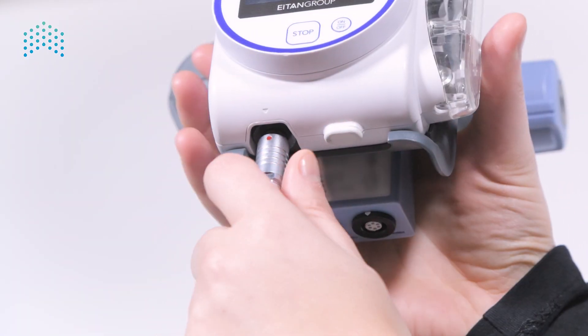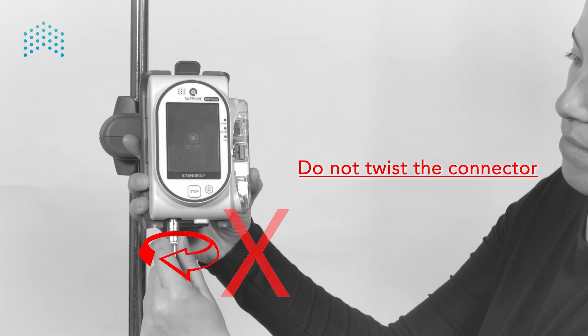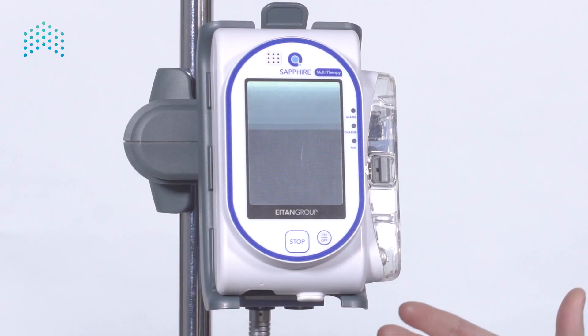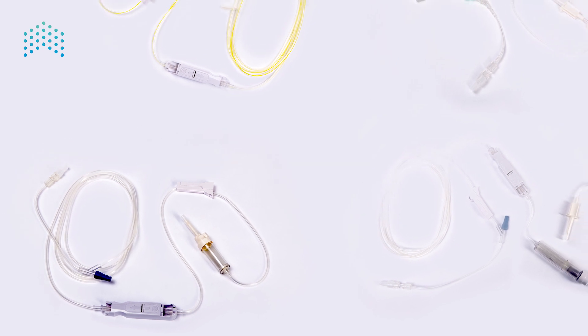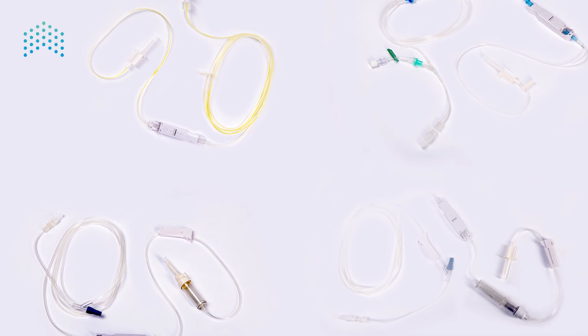Disconnect it by pulling the connector itself from the pump. Do not twist the connector. Note that pulling the cable will not disconnect the power supply. Some cradles are equipped with a splitter providing additional ports to connect the power supply.